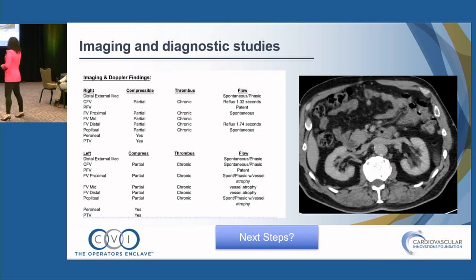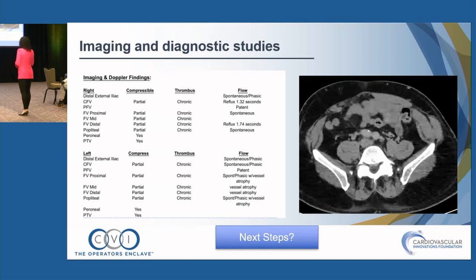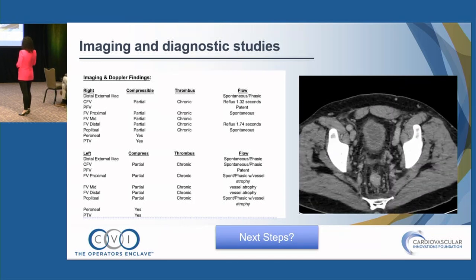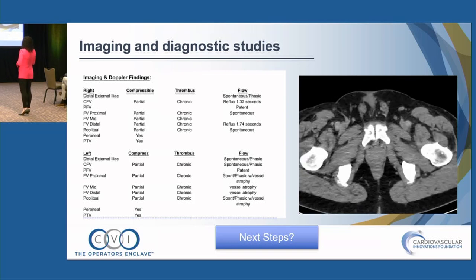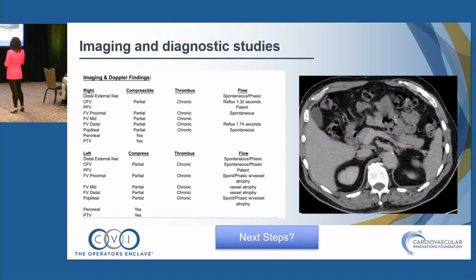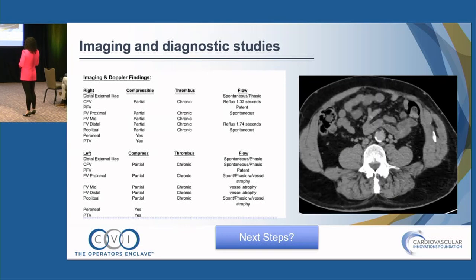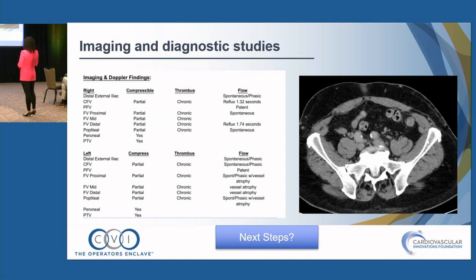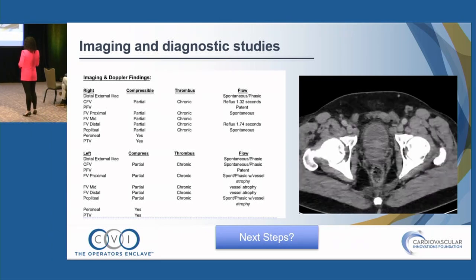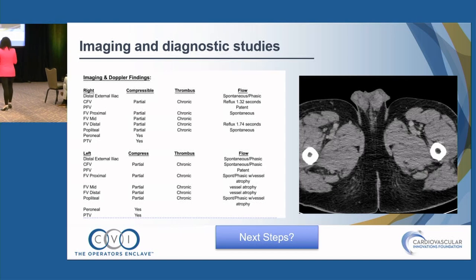When he came for evaluation of venous claudication and edema, he had a venous insufficiency study and duplex showing a lot of post-traumatic changes on both right and left, with partially compressible chronic changes from the common femoral down to the popliteal vein, with reflux on both sides. On the left, there's significant atrophy and small caliber with more extensive chronicity. I like to get axial imaging when thinking about reconstruction. On the CT scan, there was significant atresia and stenosis around the filter, but otherwise fairly viable residual lumen at the iliac level down into the groin. With this information, the patient comes in — what would you do?